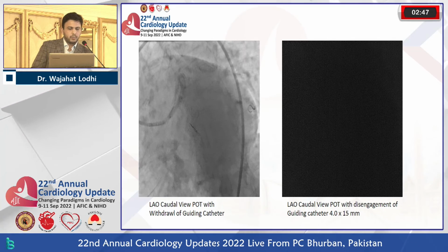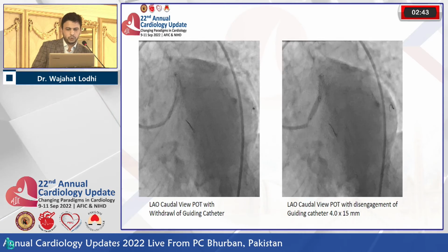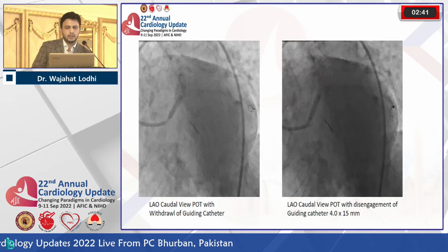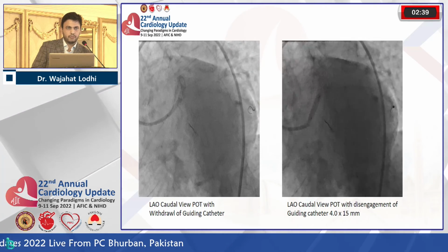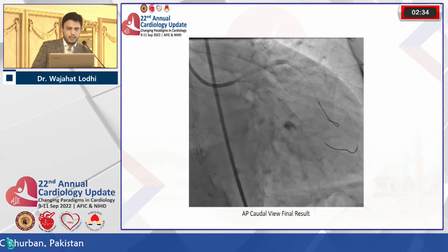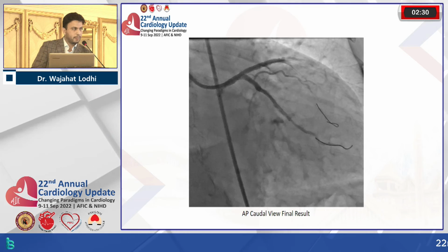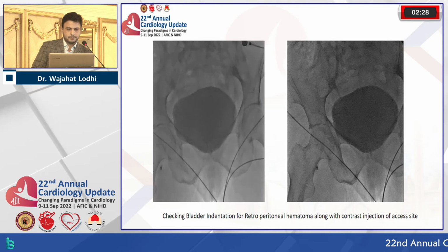We provided the last POT. It was an operator call. They wanted to do a final POT just to be sure. Again, disengagement of the catheter. We're in the sinus, we give an inflation, so we're comfortable with the 4 by 15. This was the final result, and we're happy up till here, and everything is good.